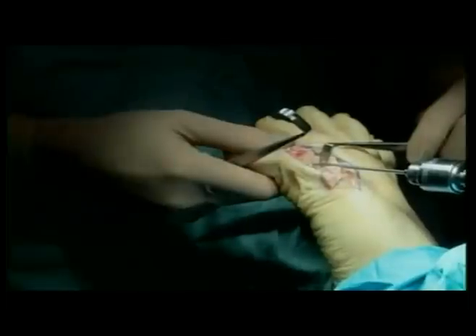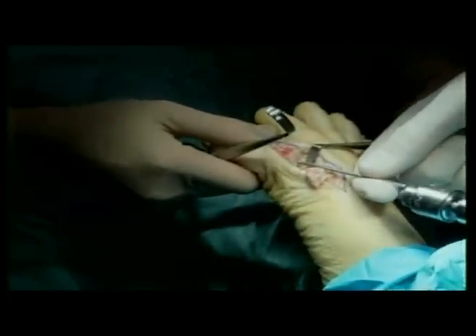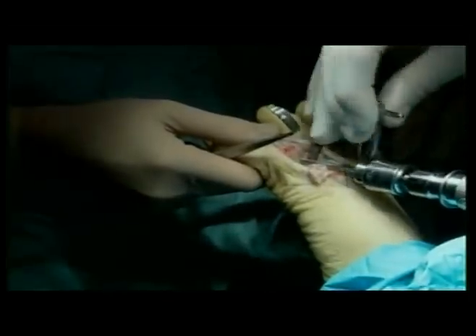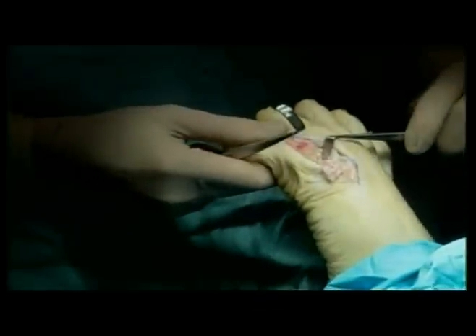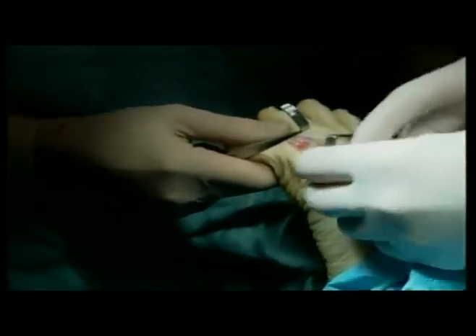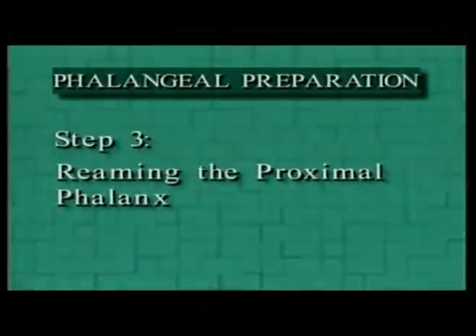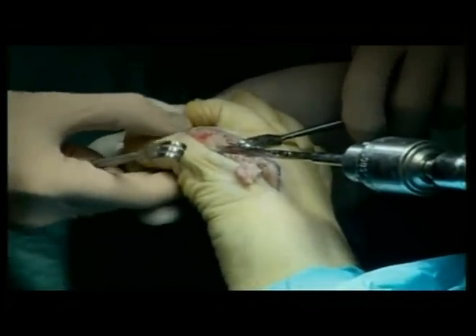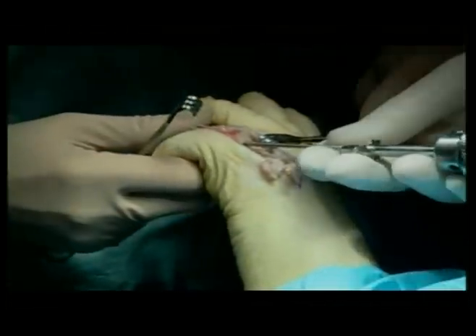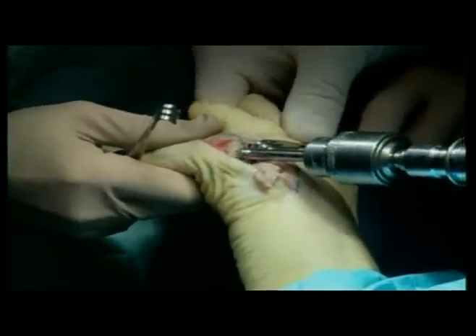Step 2: Alignment and insertion of the guide pin. Drive the guide pin into the shaft of the proximal phalanx, taking care not to penetrate the IP joint. Align the guide pin parallel with the shaft of the proximal phalanx medial-laterally and direct the guide pin toward the dorsal aspect of the IP joint in the dorsal-to-plantar direction. Once the pin has penetrated the subchondral bone of the base, it should advance easily through the phalangeal canal. Resistance should be encountered as the tip of the pin approaches the distal end of the proximal phalanx. Replace the sharp guide pin with a blunt tipped guide pin and gently tap with a mallet to seat it in the cancellous bone.